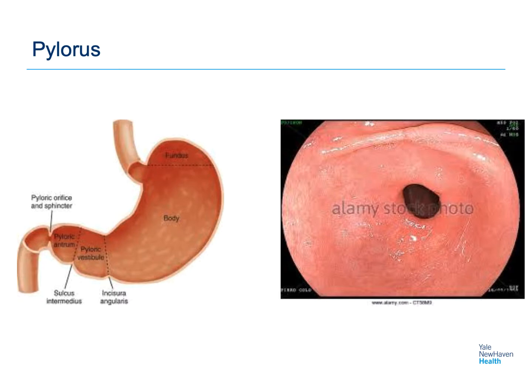I find this picture helpful because you are navigating this tube at the level of the nose. And this picture of the gastric anatomy and then an endoscopic picture of the pylorus, I think, helps to give people some background that it's actually pretty tricky to thread the Cortrak tube through the pylorus. It often takes multiple attempts of moving the tube in that direction before it will actually go through. And sometimes it's just a matter of patience and getting these tubes placed correctly.